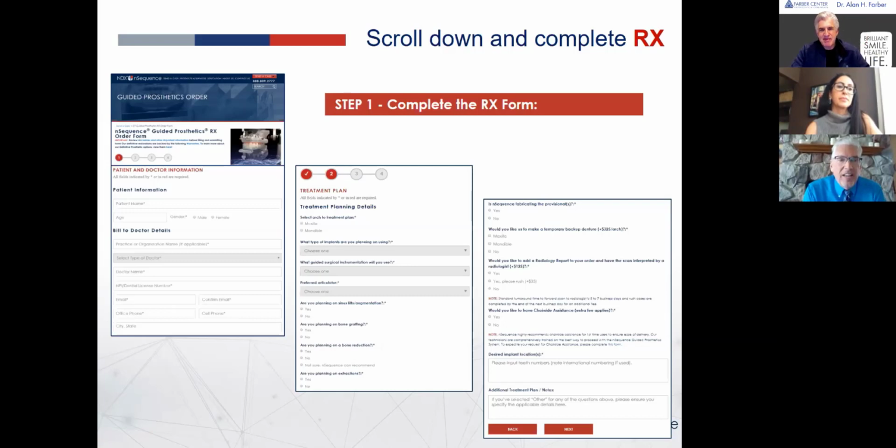You know, here's the thing. I can tell you that of all the surgeries I've done, there's only been a handful where we've needed to go to the denture. A lot of it depends on Dr. Farber's clinical skills. The good news is it's usually not a surprise on bone density. If we're looking at our scans and this is D5 bone, let's say, but I've had cases with 6 implants in the maxillary, a lot of it was D4 bone. The surgeon did some undersizing based on the implant design. Nowadays, we've got better, more aggressively threaded implants that help for that.